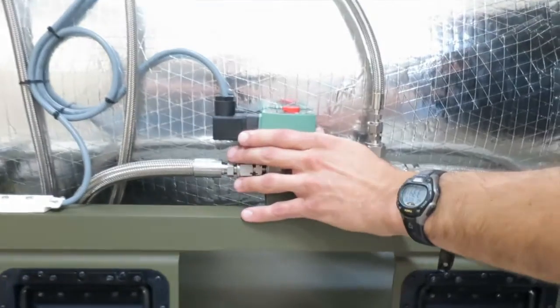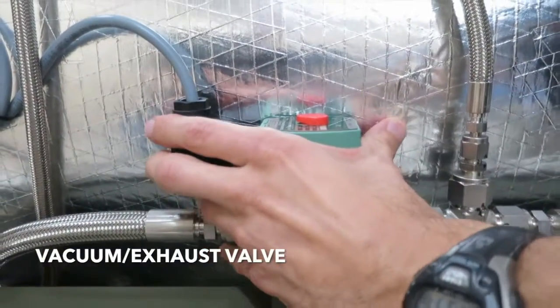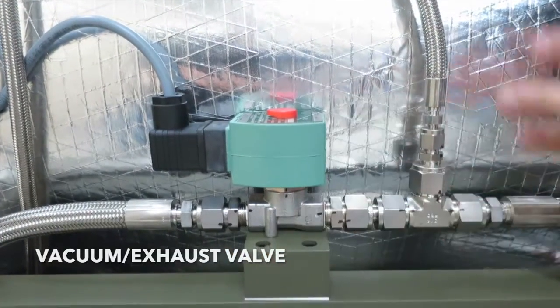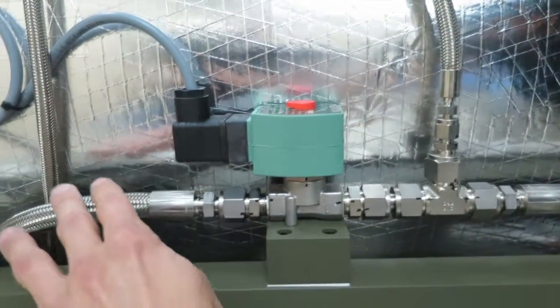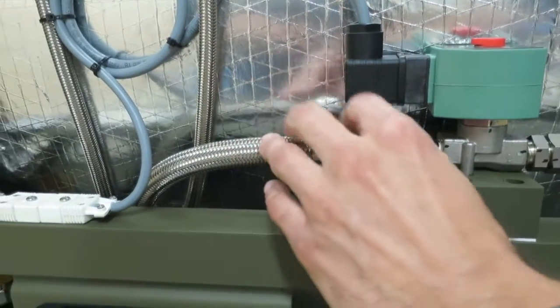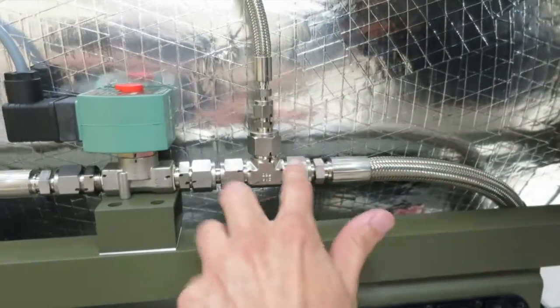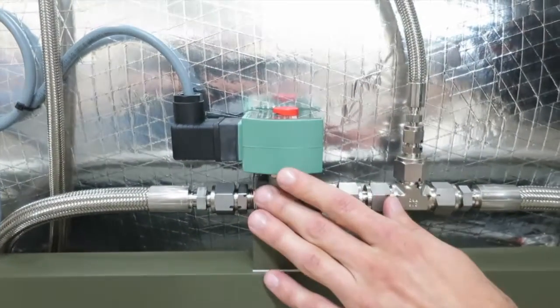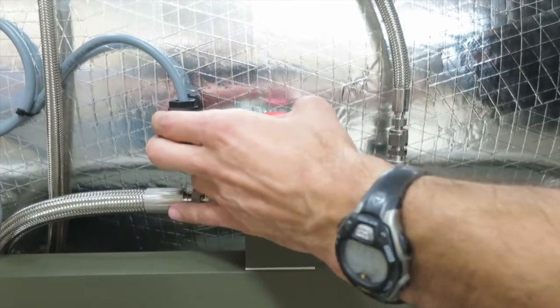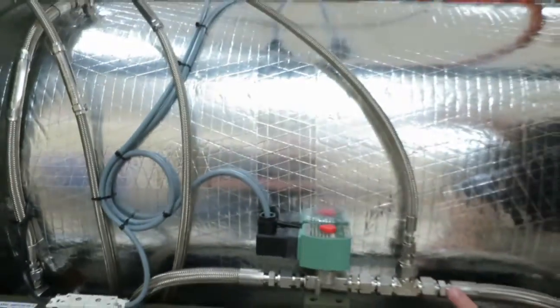Right here we've got the vacuum valve. Anytime the sterilizer evacuates the chamber, pulls out the steam and the air, this valve opens and the water recovery system pulls a vacuum through this side, and all the air and steam is pulled out of the chamber. This is a solenoid valve, just like all the other ASCO valves throughout the sterilizer. Power is applied here, and this runs back into the electrical enclosure.